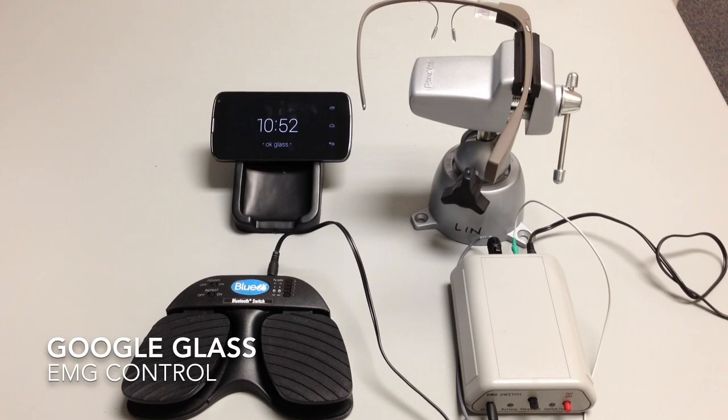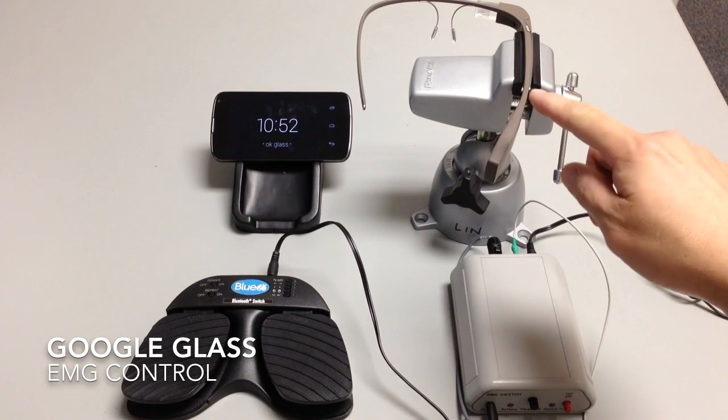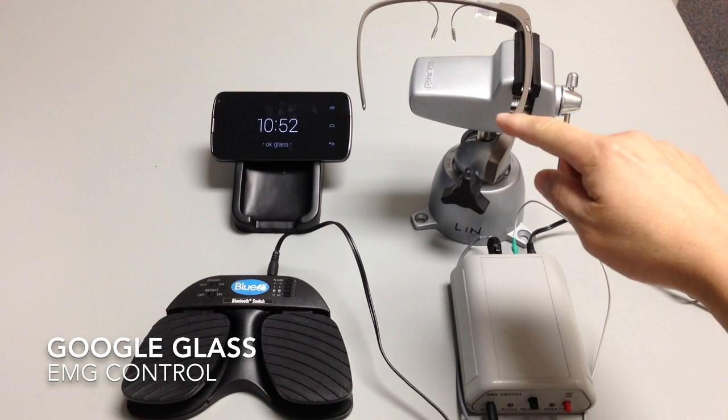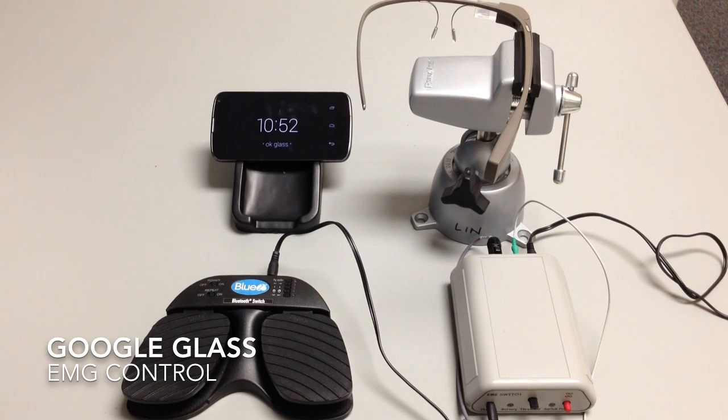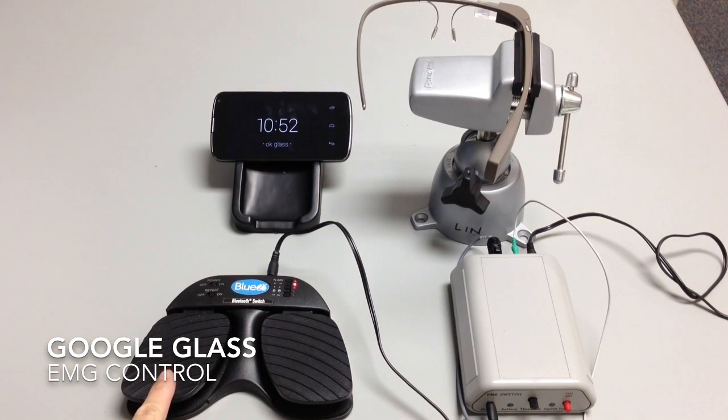What we have here is Google Glass version 2 of the Explorer Edition. This is a Bluetooth switch, the Blue 2.